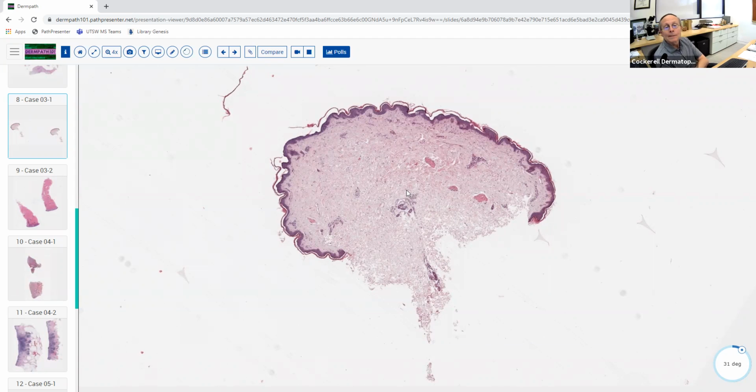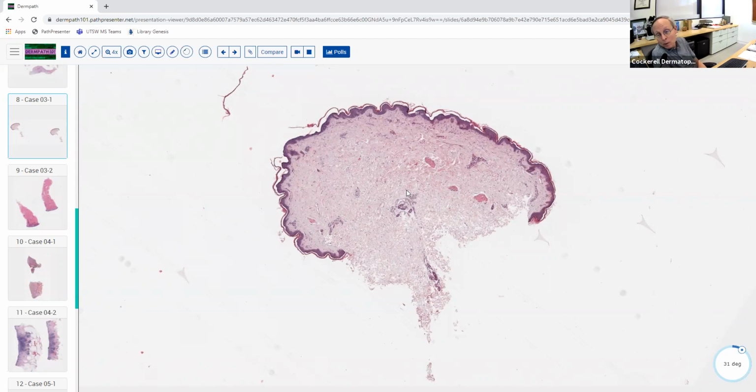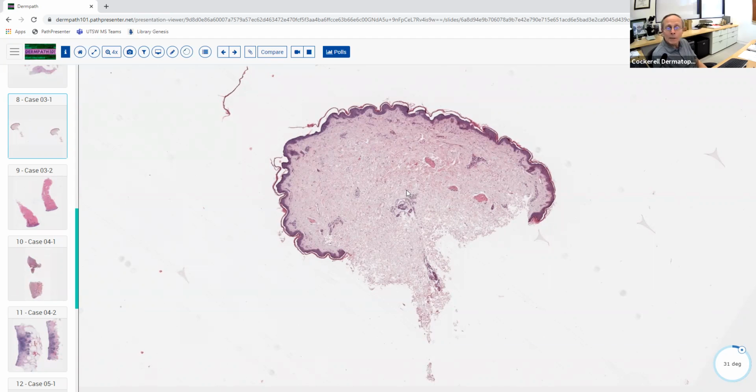What's your approach to dealing with something like this? What's the overall category when we're looking at a piece of skin like this? So the overall inflammatory pattern that we're showing here. Probably some type of collagen related disorder, disease. Well, it almost looks like normal skin, right? Looks like nothing. Probably superficial perivascular or sparse perivascular dermatitis. I mean, there's not much going on here. The last two lesions we had a lot going on. This has almost nothing.